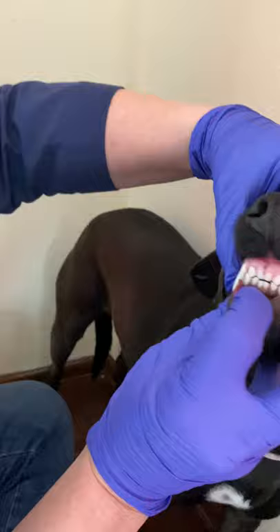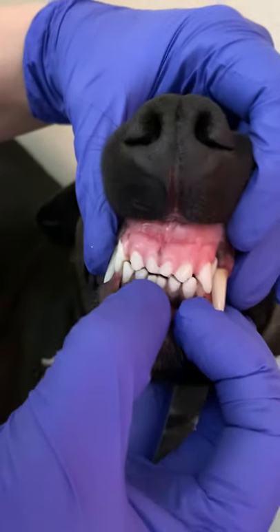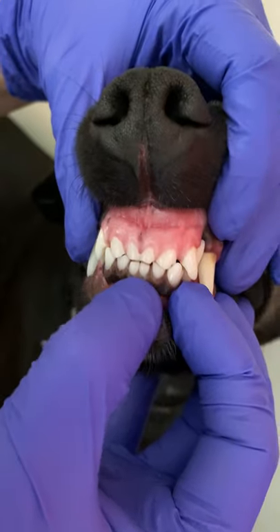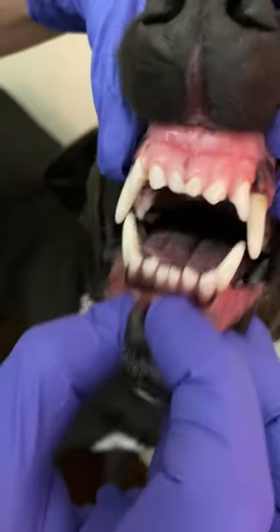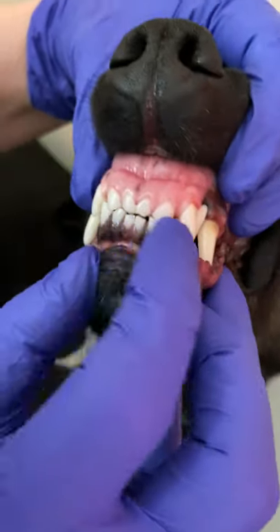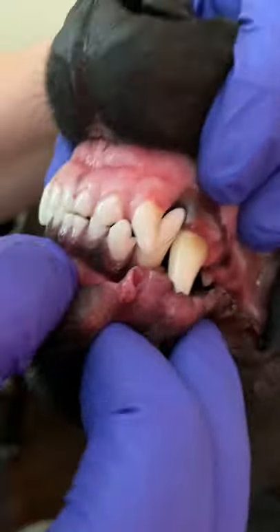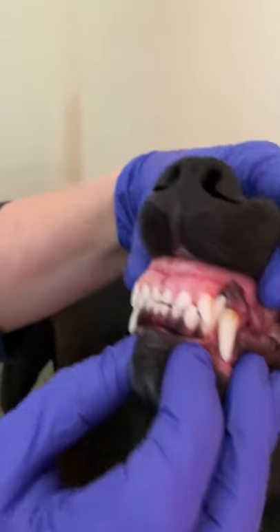In her case, she has what I call striking teeth. Her upper incisors are supposed to come over the lower incisors by just a couple of millimeters — it's called a scissor bite — but her teeth actually strike, so her incisors are worn down a little bit. In some cases that can cause pain and require extraction of those teeth.